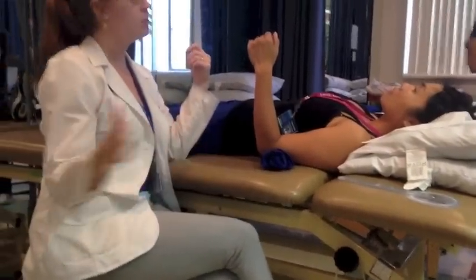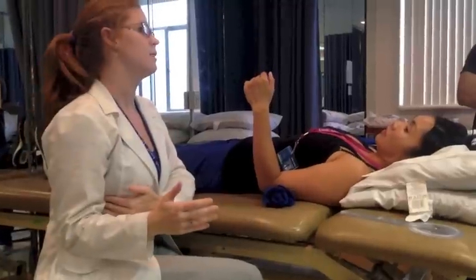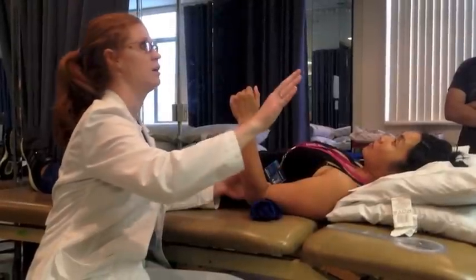For medial-lateral, I'm going to keep the arm close to the body. It doesn't have to be right up on the body touching it — you can give yourself a little bit of space. As long as it's not approaching 90 degrees, you're good to go.